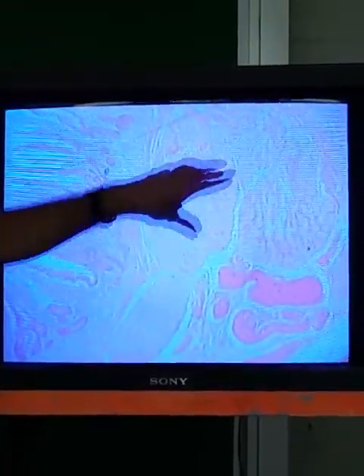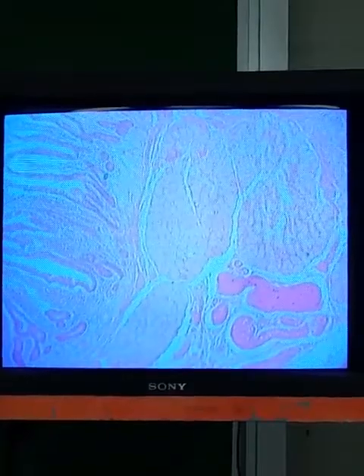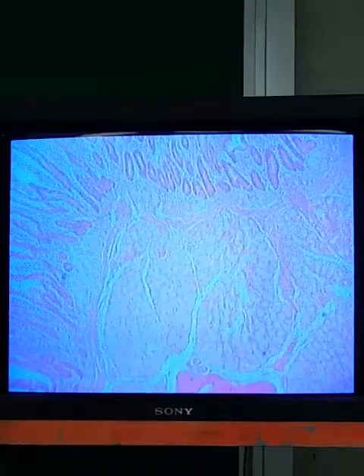So we're in the small intestine, but where in the small intestine are we? Duodenum. And you know this because of Brunner's glands. These filling your submucosa are Brunner's glands, big mucus secreting glands that are only in the duodenum, not in the jejunum or the ileum, because the duodenum is just right outside the stomach, and mucus is protection against stomach acid. So mere goblet cells is not enough protection. In the duodenum, you need these big mucus secreting glands to secrete copious amounts of mucus to neutralize the hydrochloric acid coming in from the stomach. Brunner's glands mean we're in the duodenum.